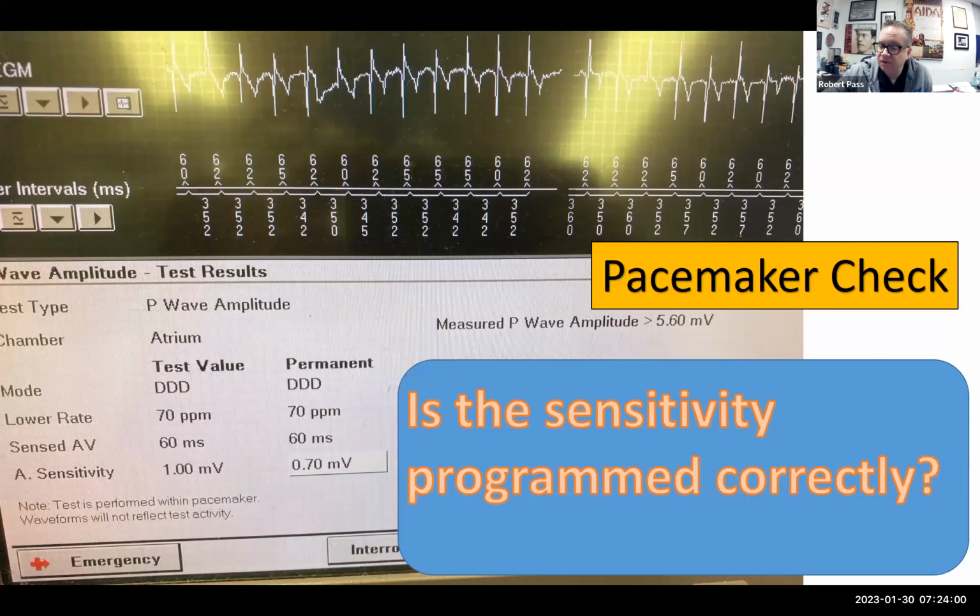Yeah. Also, if you look at the electrogram, you see that there's a lot of far field ventricular electrogram here, right? This is the A, and presumably this is the V. So you don't want the device to inadvertently sense this and be inhibited by that. So I would agree with you. It's probably programmed a little too sensitive.